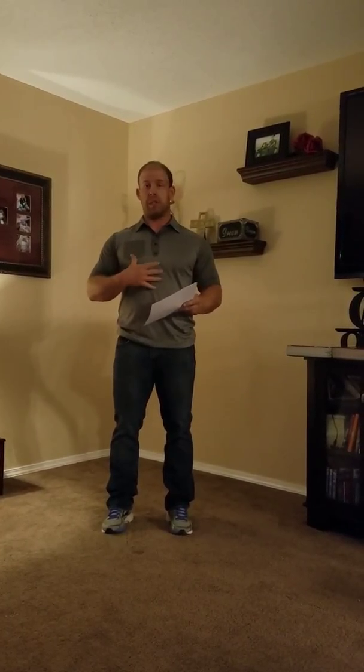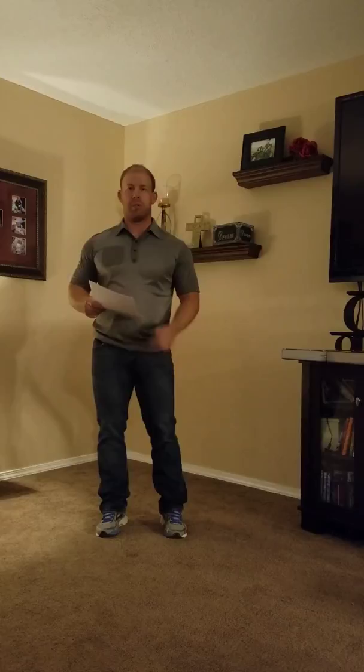First of all, what does CPAP stand for? CPAP stands for continuous positive airway pressure. It constantly forces oxygen into your airway with a constant pressure greater than your internal pressure, so it increases your internal intracavity pressure and causes some of that fluid to back up into your system and get back to the place where it's supposed to be. This is great for people with pneumonia and stuff like that. It helps them breathe a whole lot easier as long as they can take it.